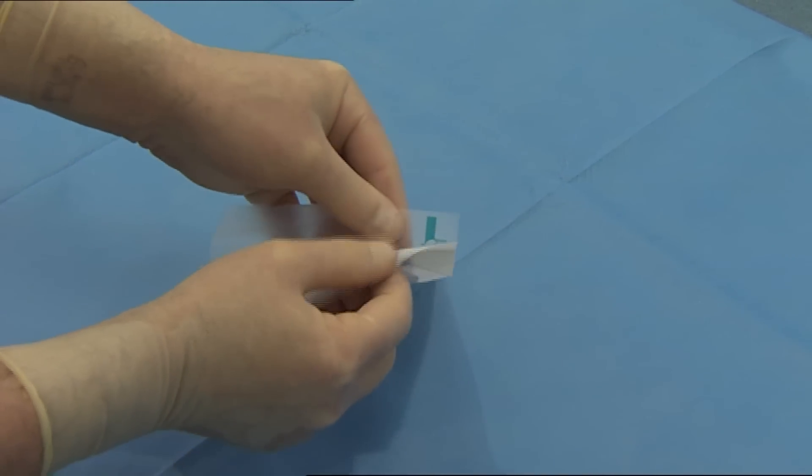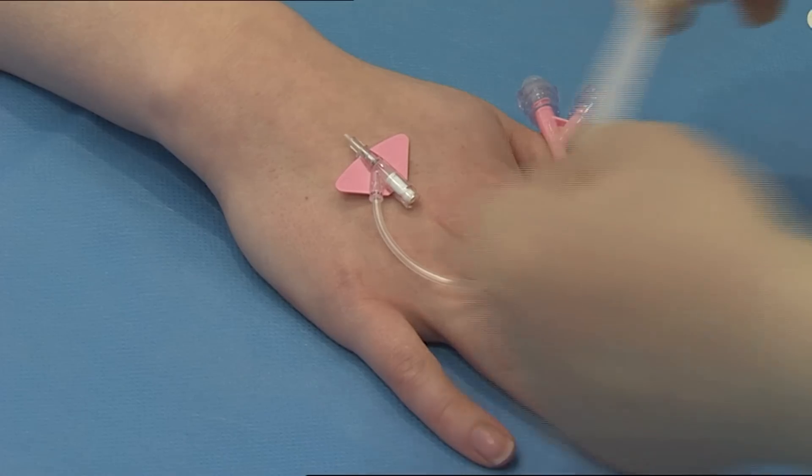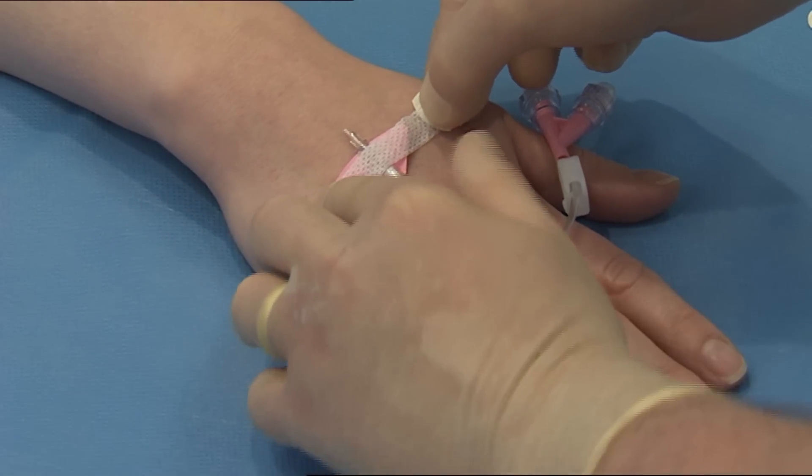Peel open the package and remove the sterilised dressing. Remove the first sterilised securing strip from the frame and place over the hub to secure the catheter.